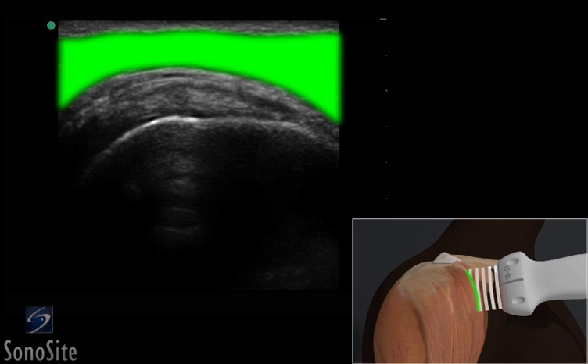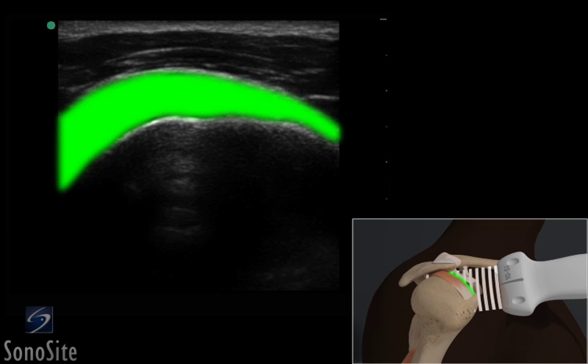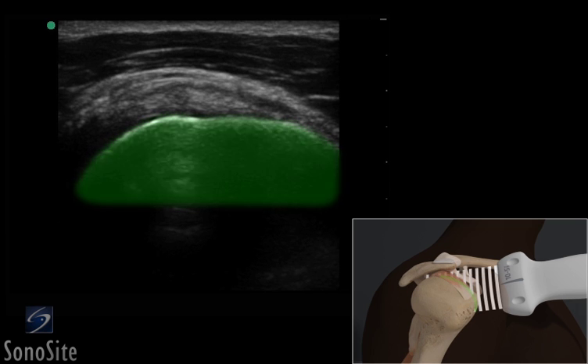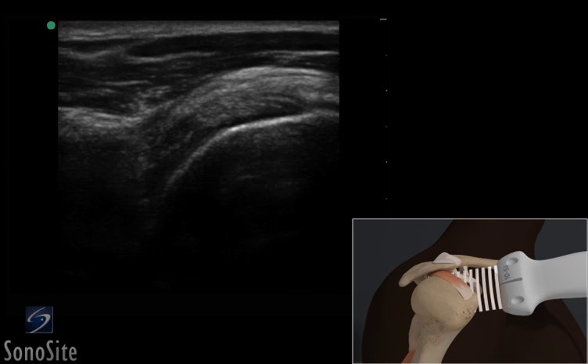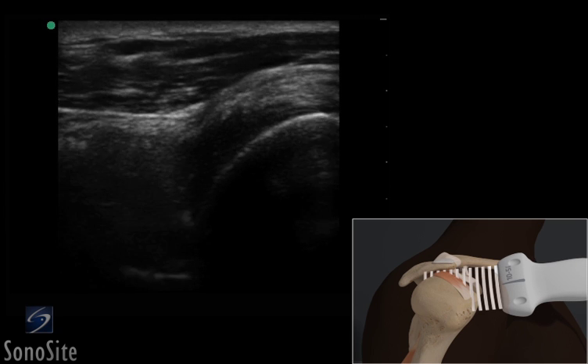The deltoid muscle is the most superficial structure in the ultrasound image. The fibrillar patterned supraspinatus tendon appears like a bird's beak as it inserts into the greater tuberosity just below the deltoid and overlying the hyperechoic humeral head. The tendon should be followed from its proximal insertion anteromedially to its musculotendinous junction laterally to evaluate the entire tendon.